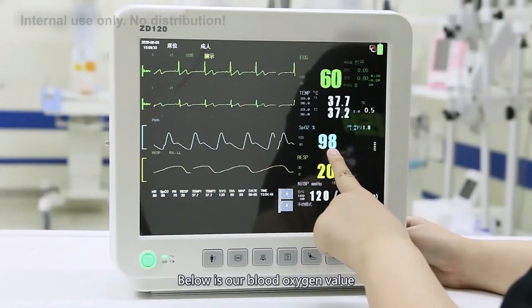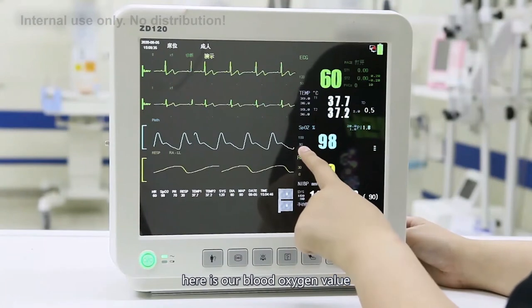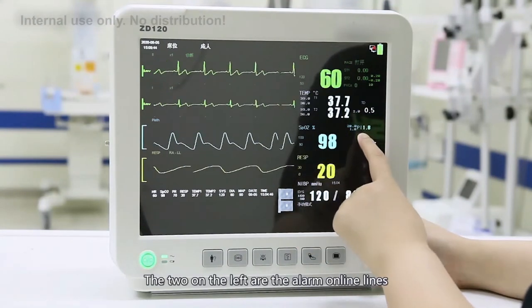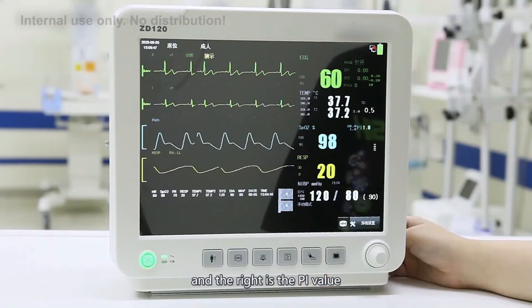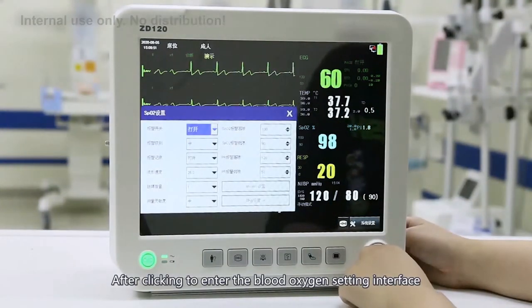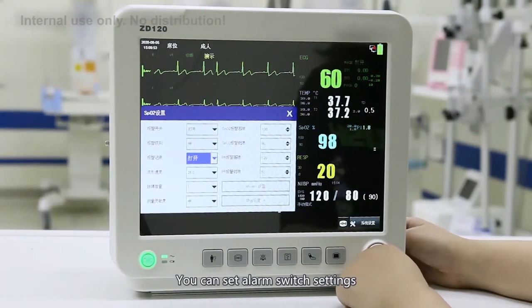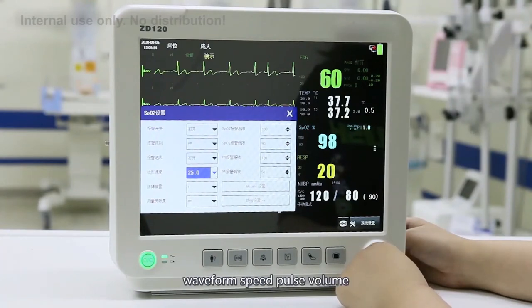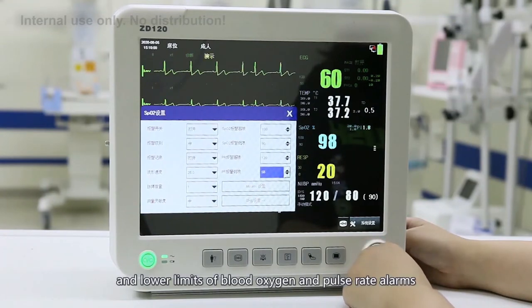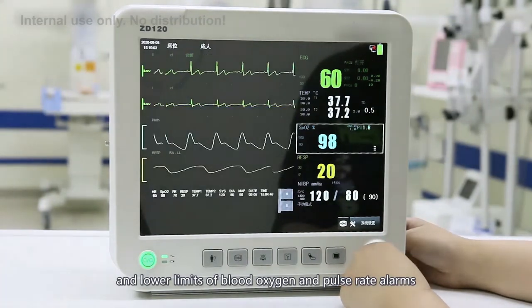Below is our blood oxygen value display. The measured blood oxygen value is shown here, with the two values on the left being the alarm limit lines and the right showing the PI value. After clicking to enter the blood oxygen setting interface, you can set the alarm switch, alarm level, alarm records, waveform speed, pulse volume, and measurement sensitivity — all of which can be adjusted. On the right are the upper and lower limits for blood oxygen and pulse rate alarms.